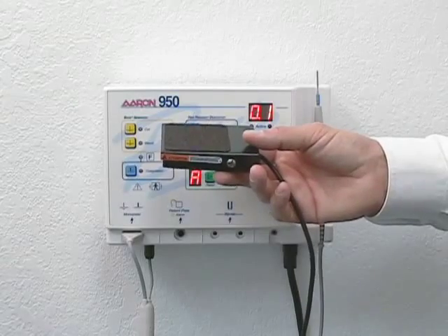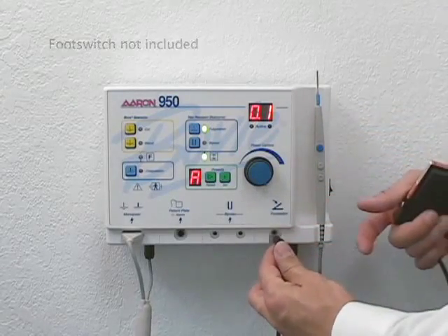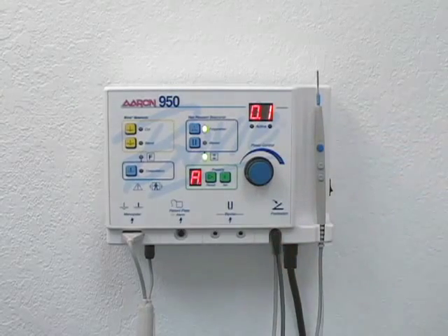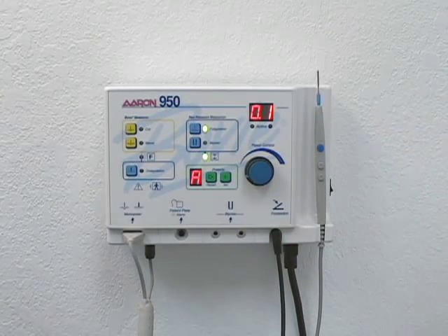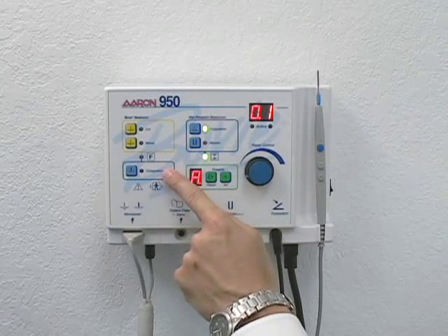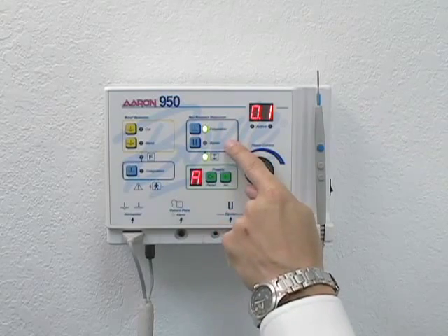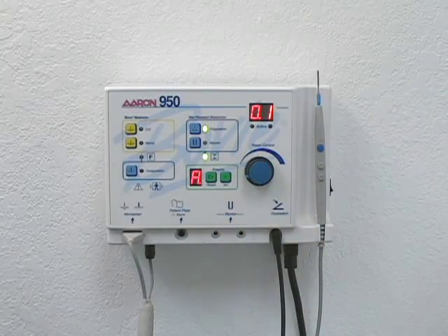To install the optional foot switch, plug the connector into the receptacle on the front of the machine. The Aaron 950 has five operating modes: cut, blend, and coagulation, which require the use of a grounding pad; and fulguration and bipolar, which do not require the use of a grounding pad.